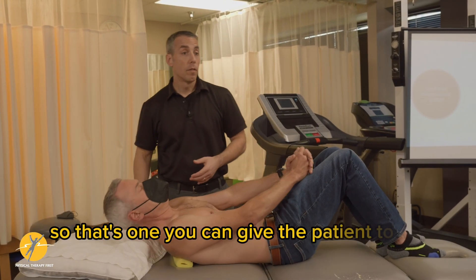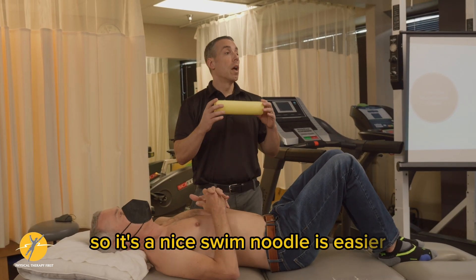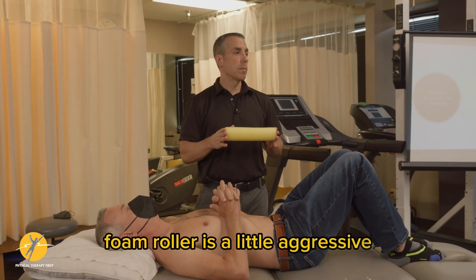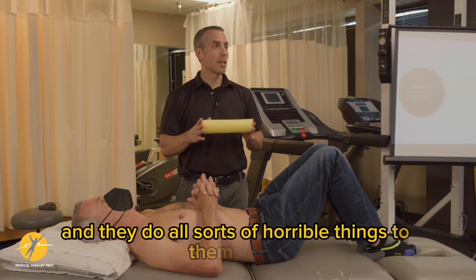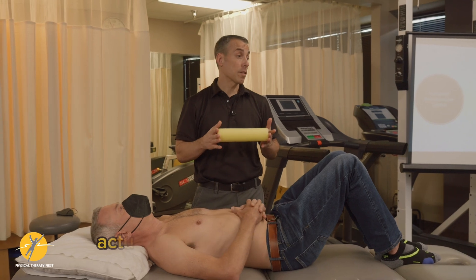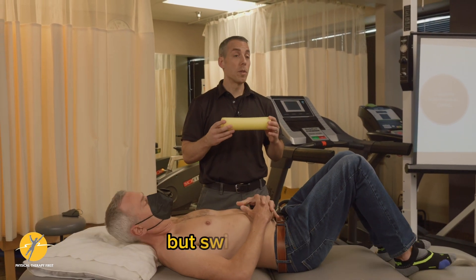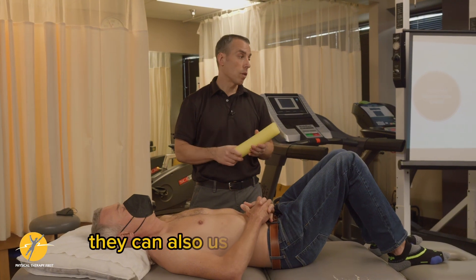That's one you can give the patient to do — five or ten minutes. A swim noodle is easier. A foam roller is a little aggressive and people tend to waterfall over it — they do all sorts of horrible things to themselves with the foam roller and interpret it as good. Some people actually have good results with it. But a swim noodle is not that expensive and it's comfortable for patients. They can also use a rolled-up towel.